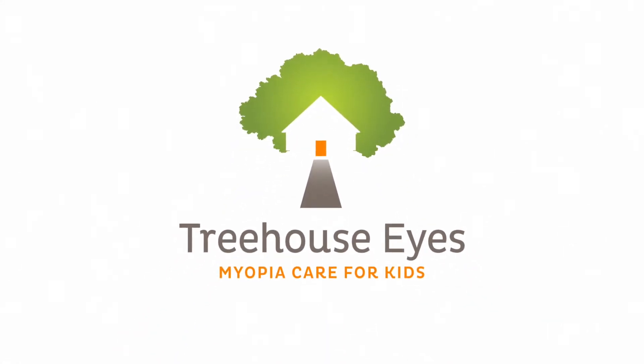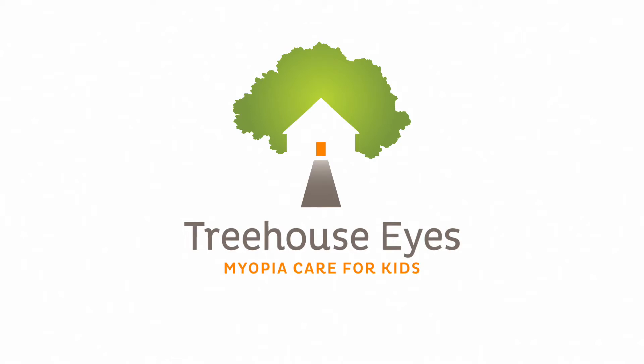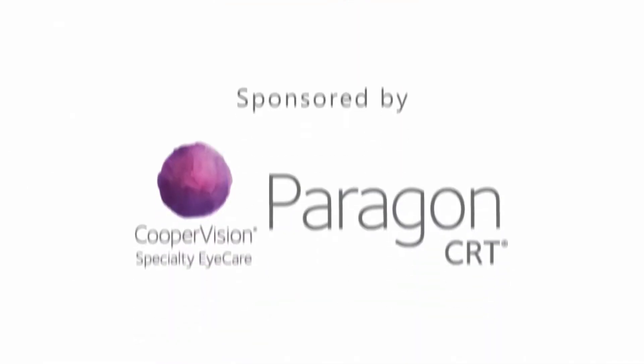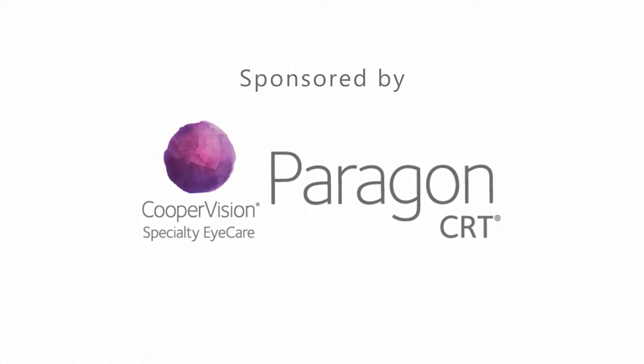Congratulations on starting myopia treatment with your Treehouse Eyes doctor. This video lesson has important instructions for your overnight contact lenses. Please watch it carefully to learn to apply, remove, and care for your customized contact lenses. Thank you to CooperVision Specialty Eye Care for their support of this instructional video.